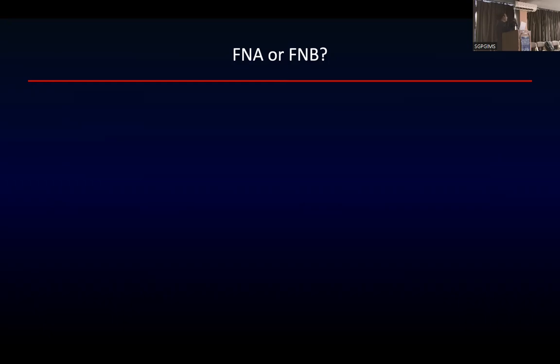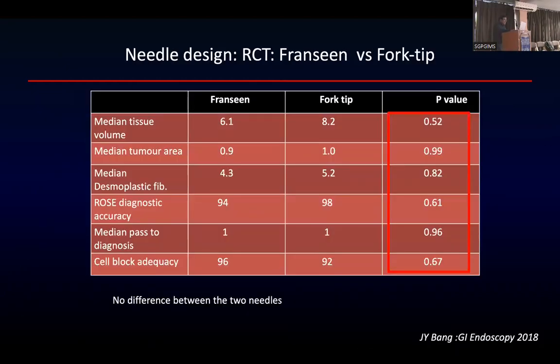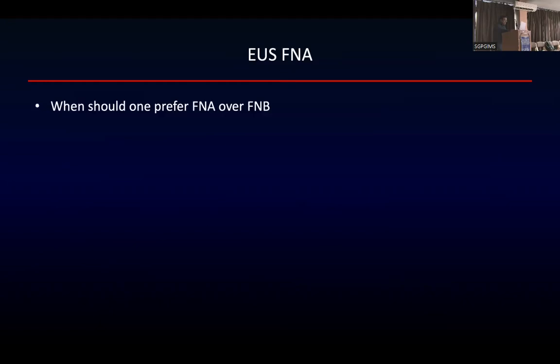So with FNA, you can't do an immunohistochemistry, which you can do with an FNB needle. So there are all reasons why FNB would be the norm with time. Only problem right now is FNB is slightly costlier compared to an FNA needle. Moreover, we are using the 19 gauge FNB for liver biopsy, which we will show today. And that's obviously slightly more costly compared to a 22 gauge FNB needle. Okay, so these are various needle designs and needle material.